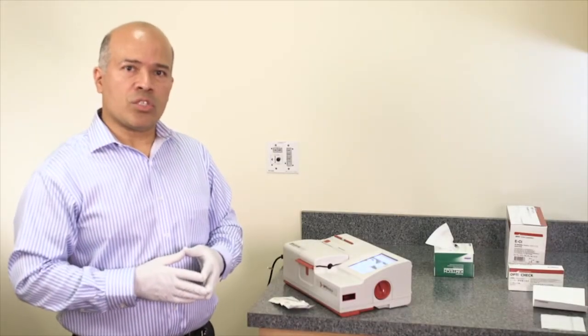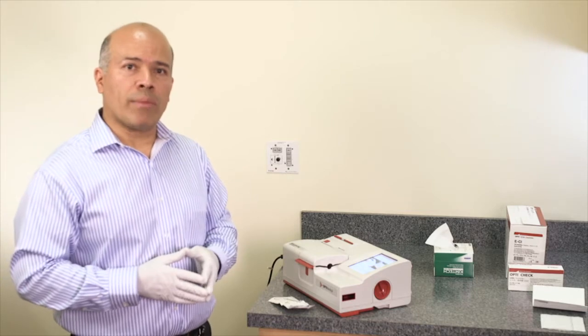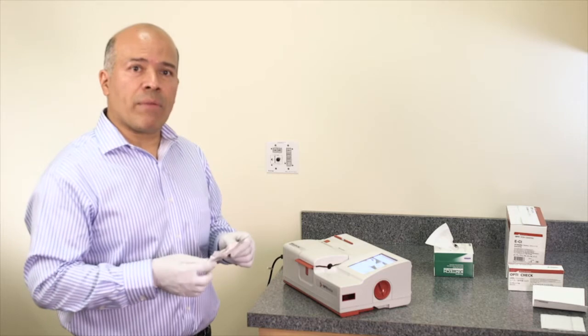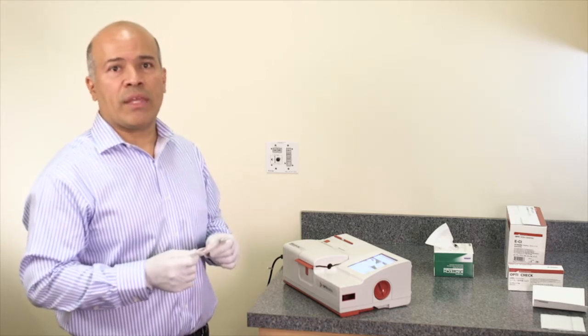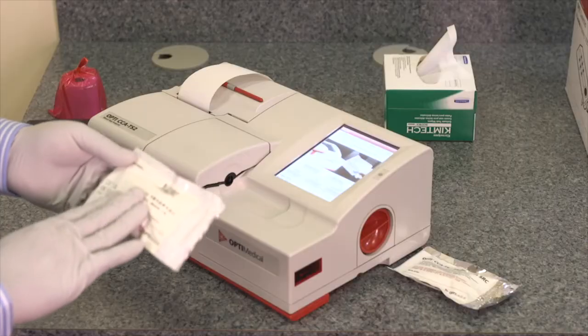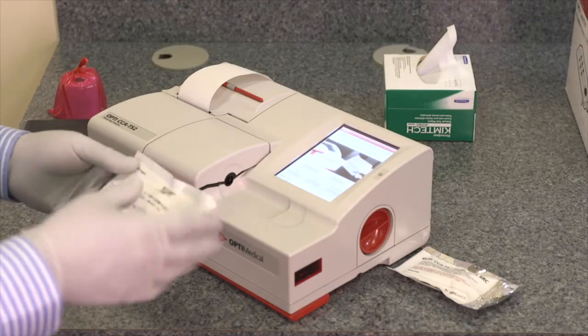The OptiCCA-TS2 analyzer comes with a total hemoglobin calibrator cassette. This calibrator cassette has to be run every three months to calibrate the hemoglobin. To run the calibrator, the user has to swipe the barcode on the barcode reader of the analyzer.